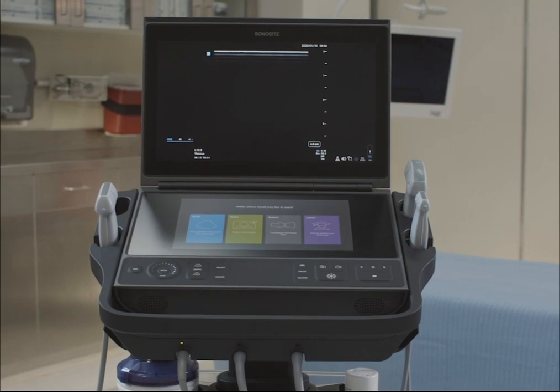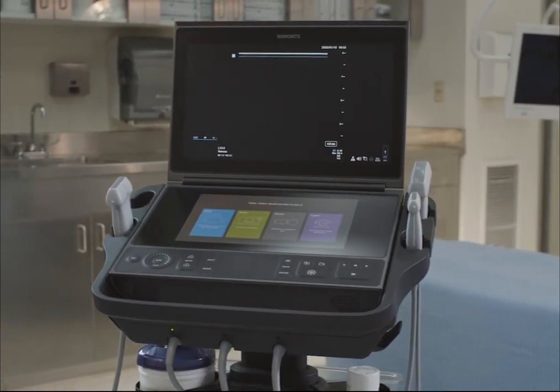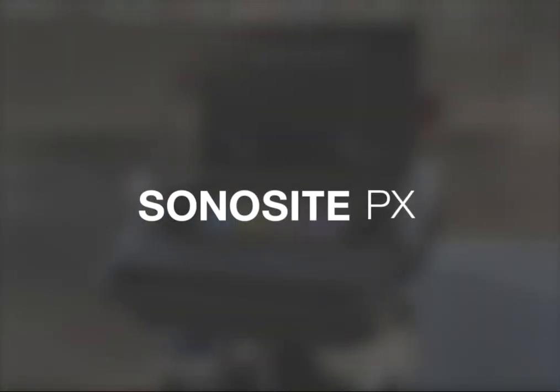Welcome to the Sonosite PX. Our high-end, compact ultrasound system is designed to be portable, fast, and support both procedural and diagnostic needs. This video gives you an overview of the system.